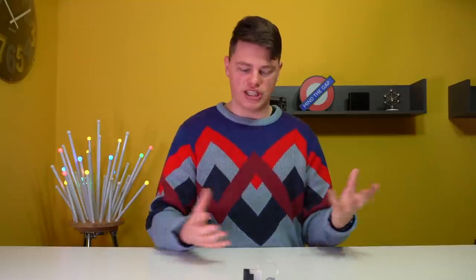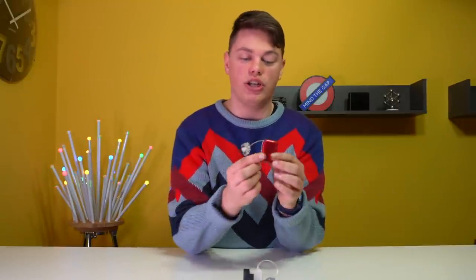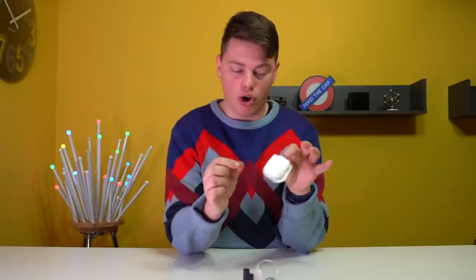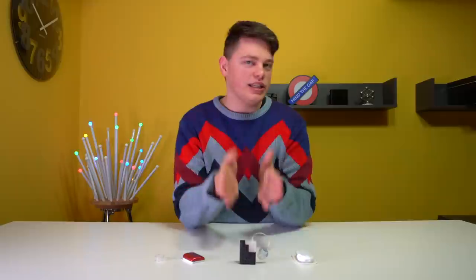Patch is not a new concept — we have multiple pumps in the patch category. To name a few, we have the Kaleido patch pump, a very colorful patch pump, and we have the AccuCheck Solo from Roche Diabetes Care. The T-Sport from Tandem is somewhere in the middle of both of those.